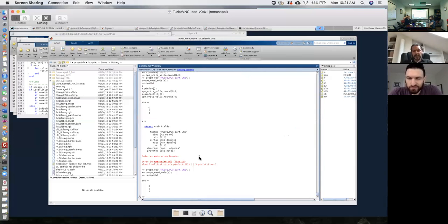For some reason, the imcalc command is doing this weird conversion where it doesn't use the format that we ask it to use. We are asking it to write these files as integer numbers, and it's using something else for some reason. So I'll figure that out, and I'll let you know how to use the proper command in SPM imcalc to force it to use the proper format for these numbers. But a workaround is just to recreate it manually.